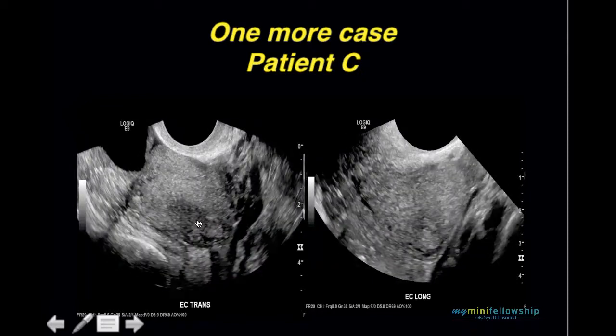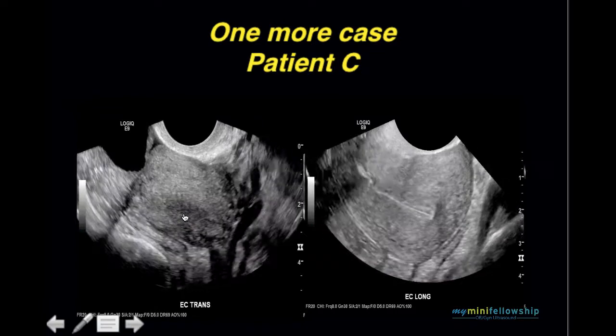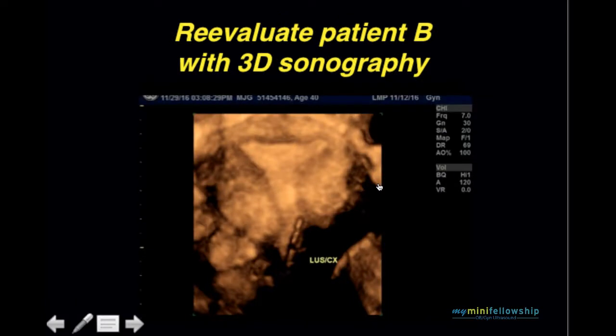Well, that's the transverse scan. You can see we're up by the corner. Too high, so it's too low as well. Oh, it's really low. Now, when you look at the 3D images, you can see without question that, first of all, the side arms never deployed. And secondly, the IUD is literally in the patient's cervix.